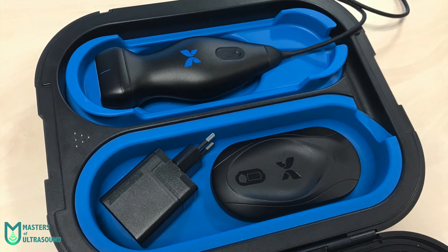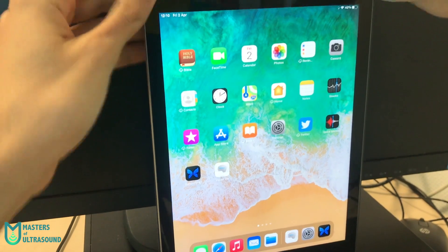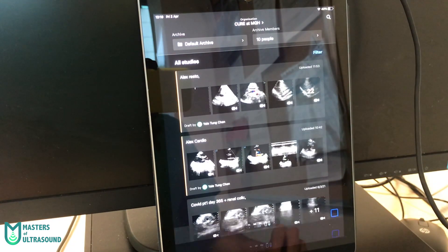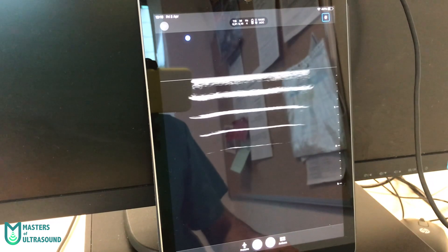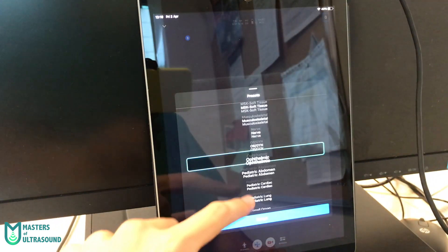Now let's see how to set it up and start scanning. It is a pretty fast process — you just plug it in, click on the app, and after a few seconds you're ready to scan. From there you can simply choose the preset.